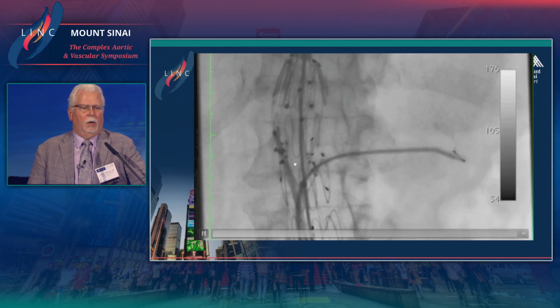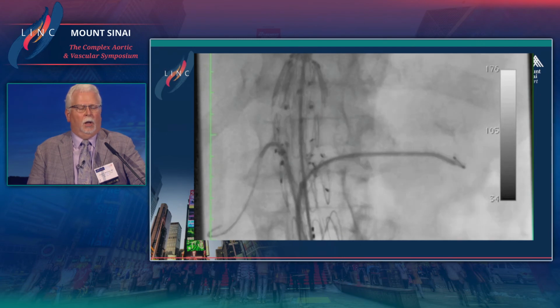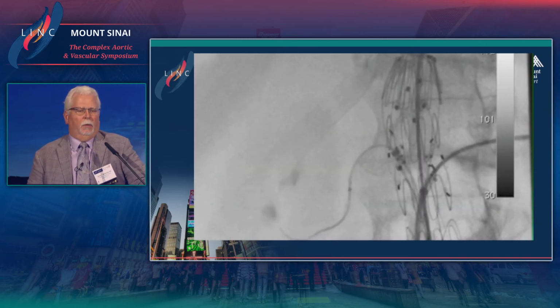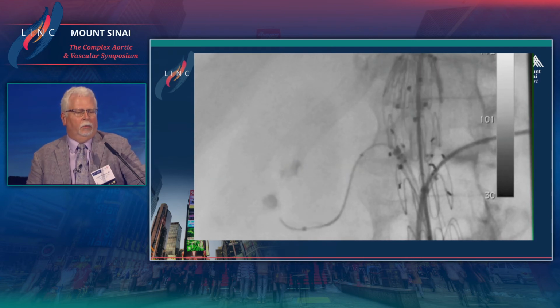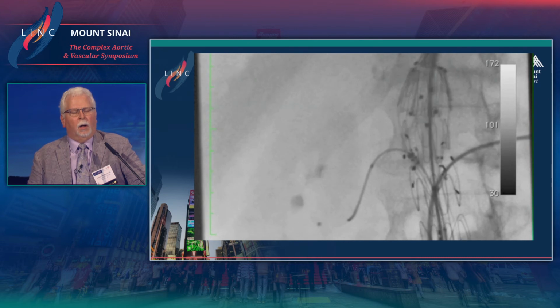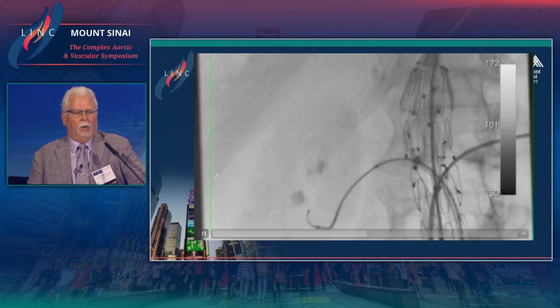Curlicue catheter again, and you're able to flex that and move that in and out of the sheath to change your angulation until you're able to engage the renal vessel, as you see here. Then you come out with a flexible catheter to go out into the renal vessel itself, and then come with a supportive Rosen wire to give you stability as you come through.